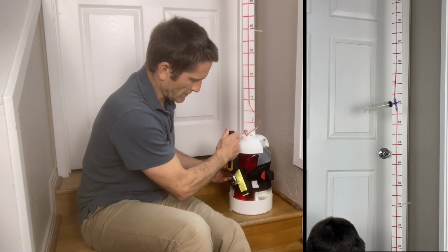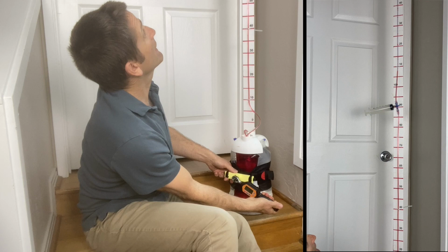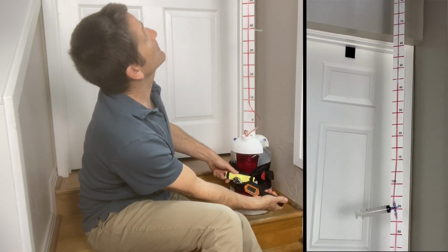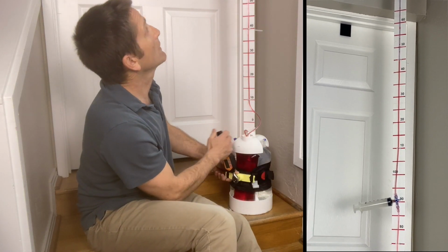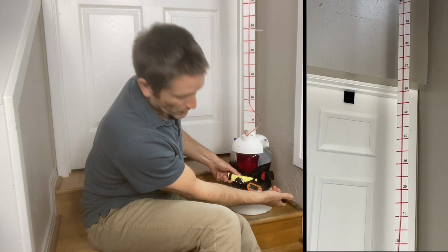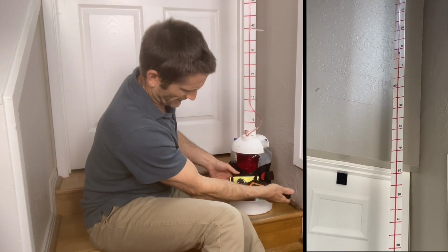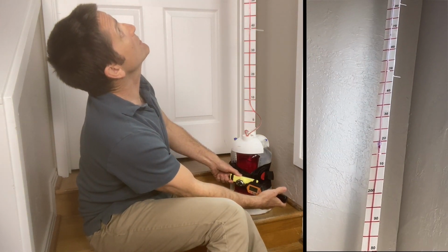I can feel it's going to catch here. So 1.39, and nothing has changed to the pressure there. 2.13, the pressure is up to 145. 3.69, pressure is up to 195. 4.52, my pressure is 255.